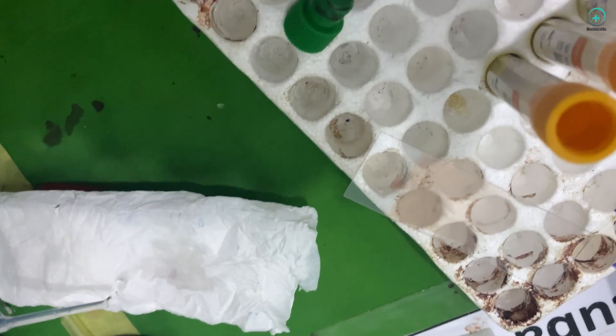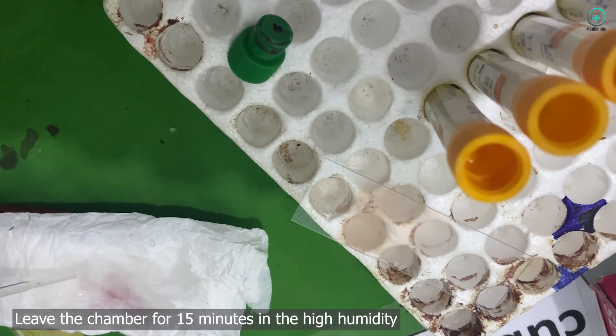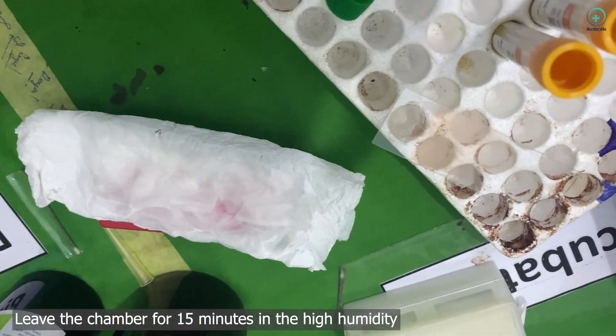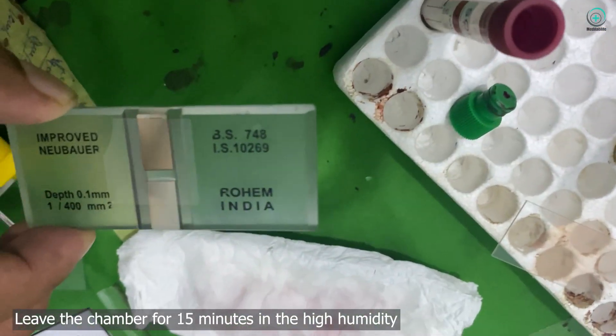Step 5: Equilibration. To prevent drying and ensure even cell distribution, we leave the prepared Neubauer chamber in a high-humidity environment for another 15 minutes.